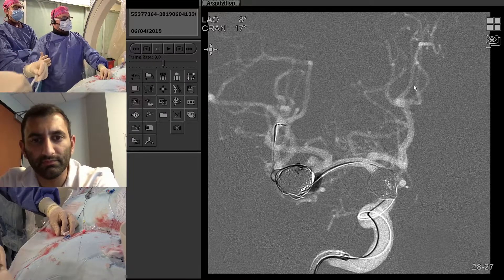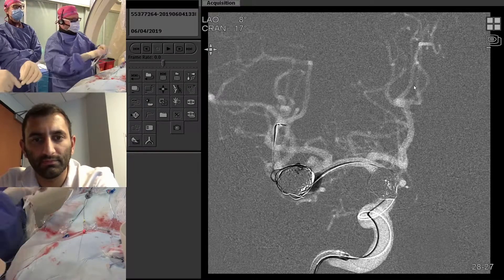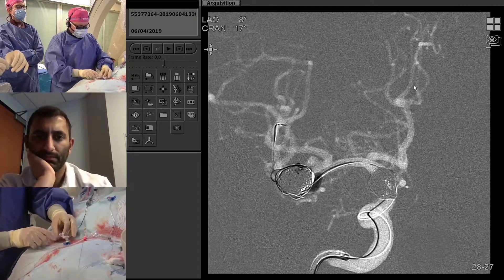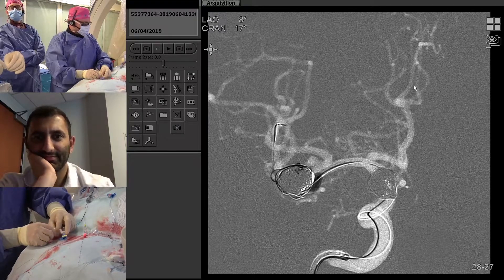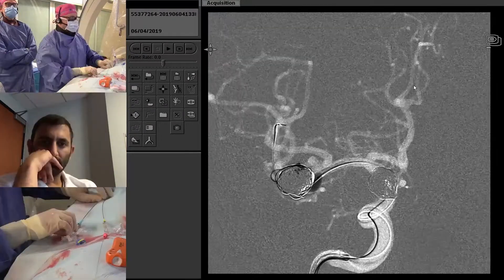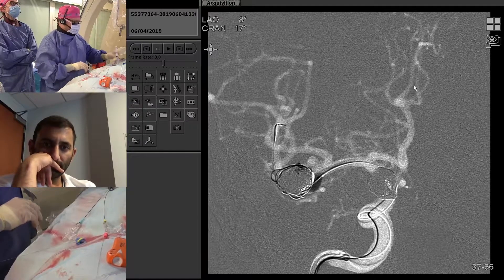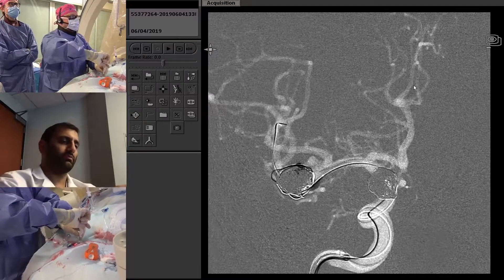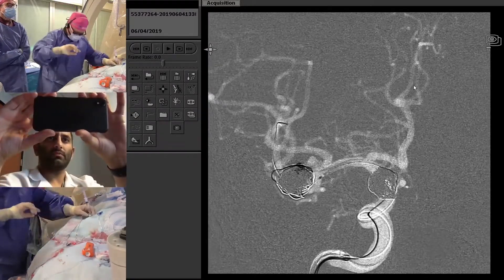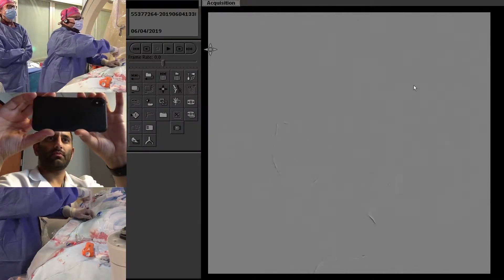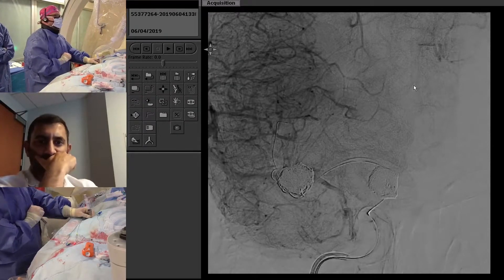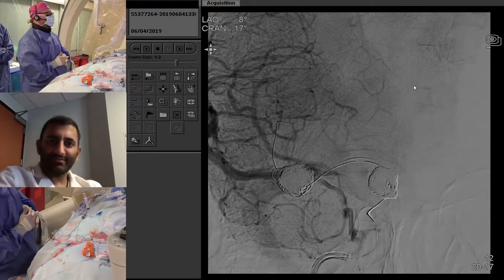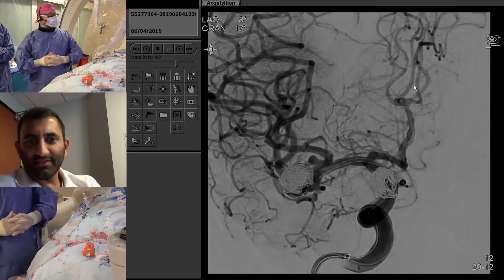I'm going to put one more coil into that little area. Her vitals are all stable and she's doing well. I'll be ready to do my run when I deflate the balloon — hopefully we don't see extravasation. I'm bringing the balloon down very slowly and gently but keeping it in place, ready to go back up if needed. Listening to heart rate for any changes — none so far. I think we have a pretty well-treated aneurysm. It looks really good, and I don't think we need to push for anything more.